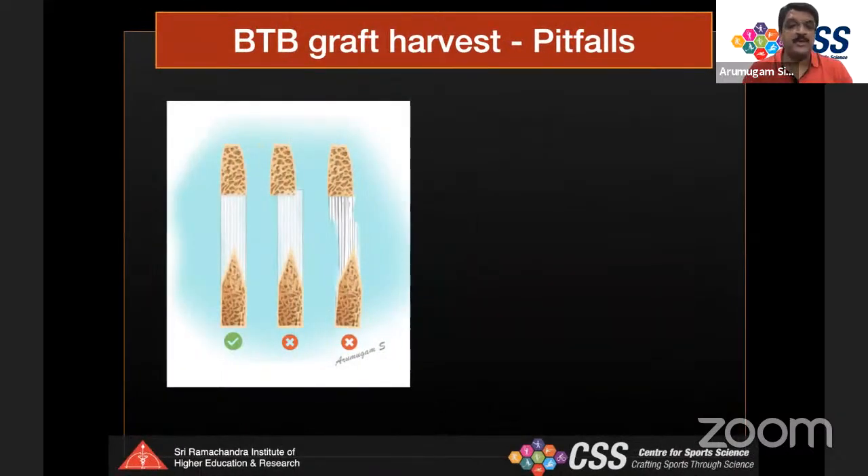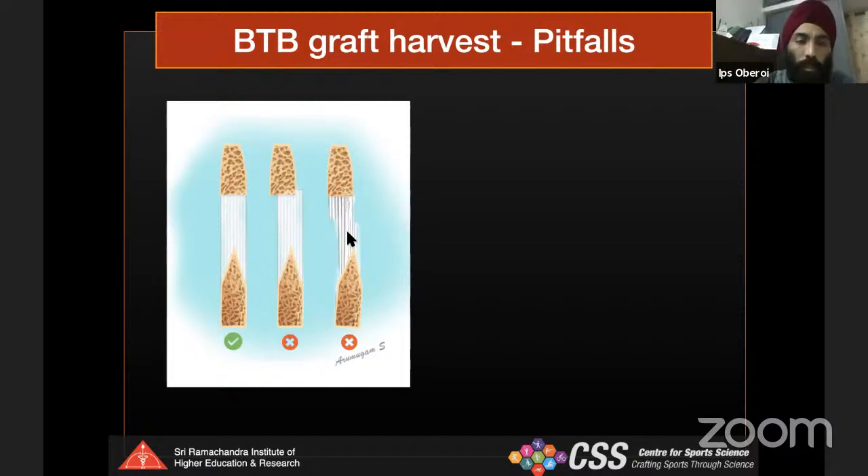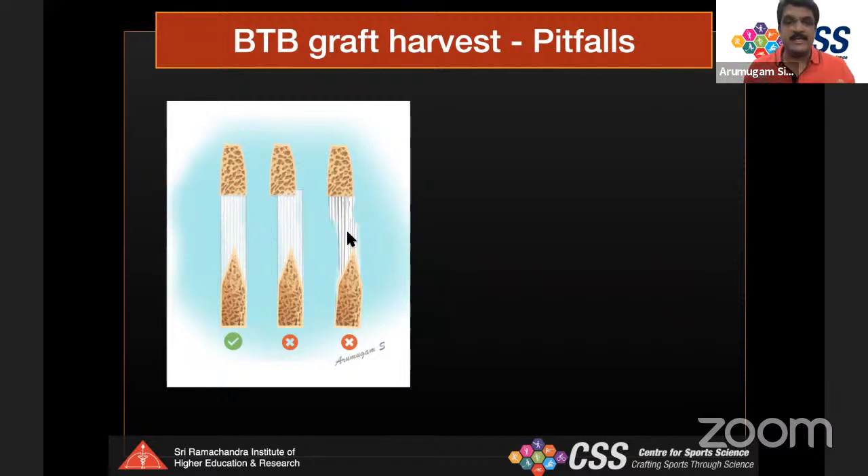Regarding ideal graft appearance: the two bone plugs on the patellar tendon should have tendon fibers running continuously end-to-end into the bone plug. If the tendon fibers do not attach properly into the bone plug, or if the tendon is wider and fibers are not incorporated, the graft is suboptimal. Making the tendon incision at full tension — starting at 30 degrees then 110 degrees of flexion — prevents this problem.